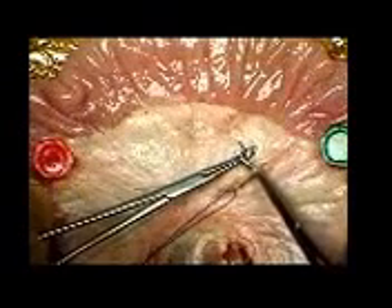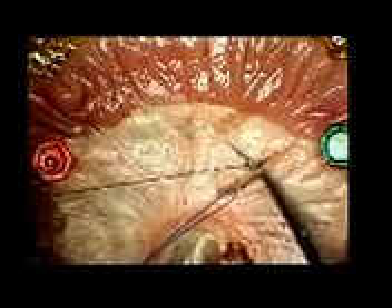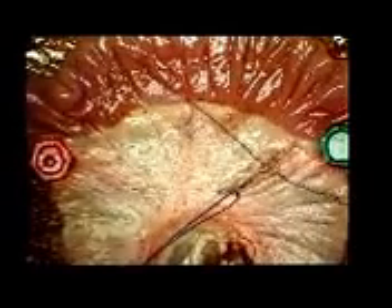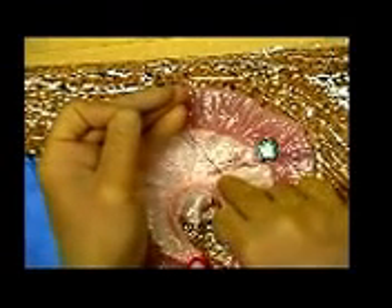The two ends of the ligature are then placed in a hemostat. This manoeuvre is repeated to pass a second ligature beneath the vessel. The first ligature is now tied in a reef knot with four or five throws when using vicryl.